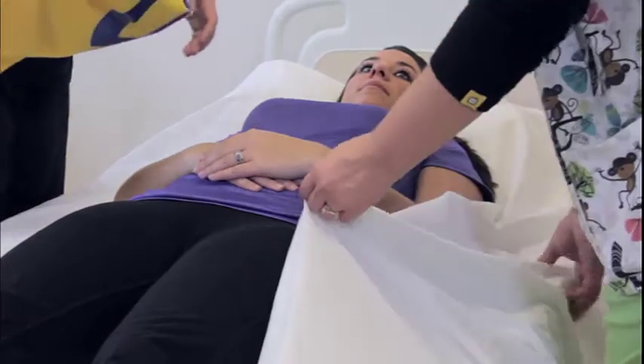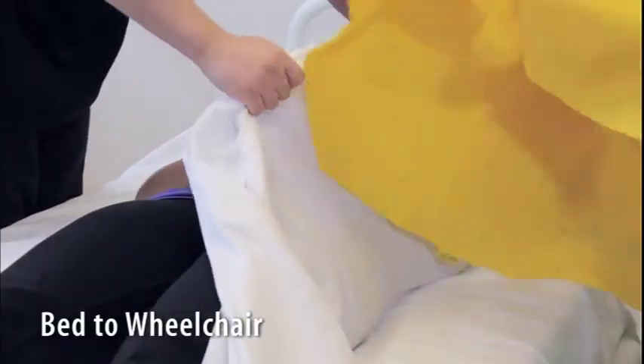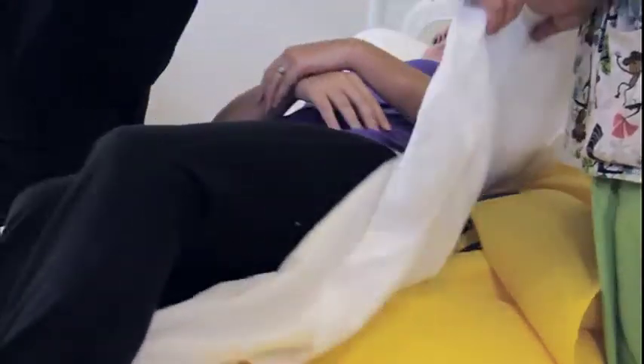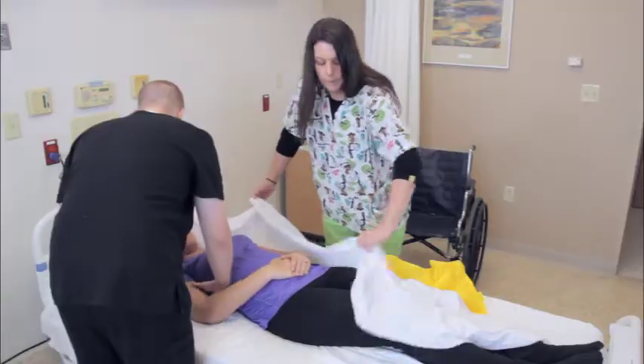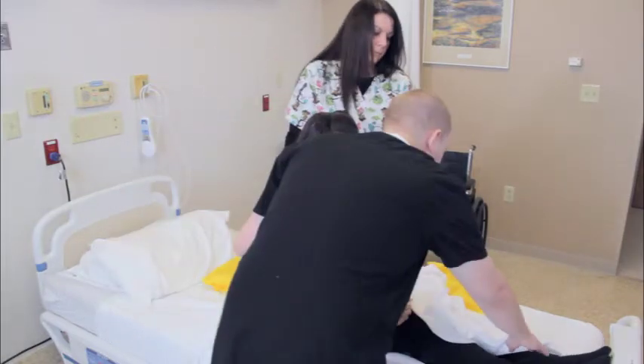Slip can also be used for transferring a patient from the bed to a wheelchair. To begin, place the Slip under the patient by turning the patient onto her side and making sure the draw sheet is over the Slip. Check to see that the patient is securely on the Slip. Sit the patient up in bed, making sure to firmly support her as you lean her forward.